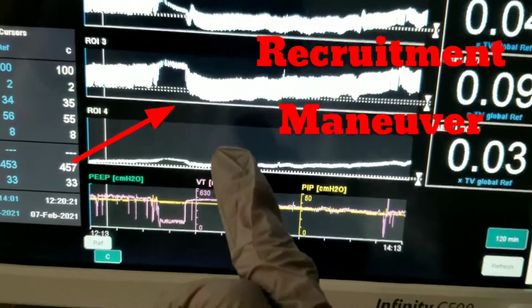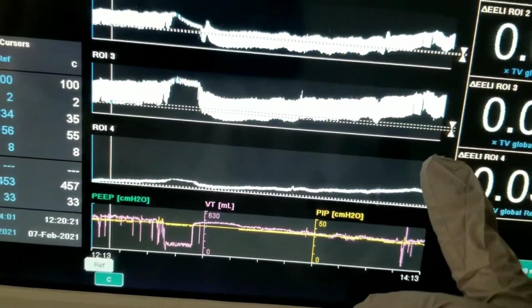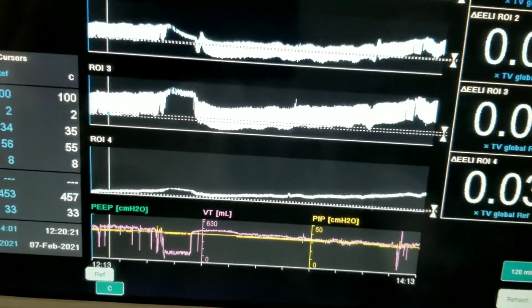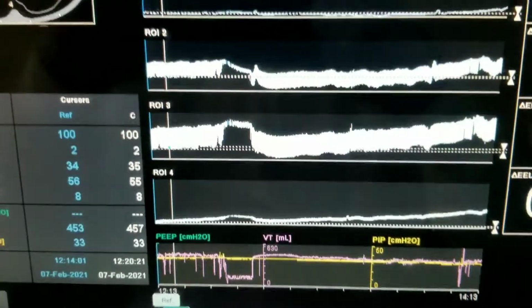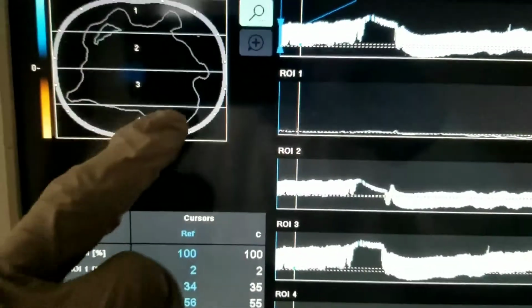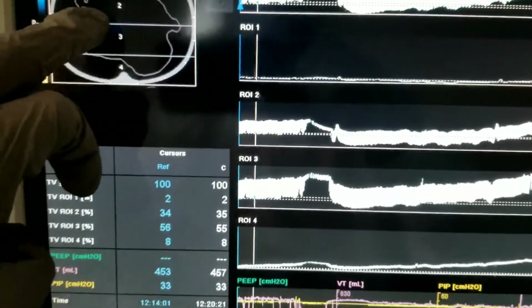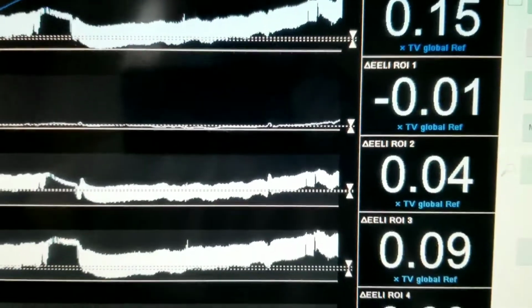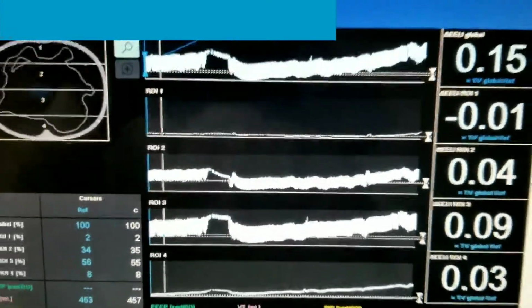So obviously we're increasing the amount of volume in the dorsal region. That's excellent, and we're doing this not by increasing the pressure, we're doing this by decreasing. Therefore, we're going to expect as we scroll some blue in this region, and eventually probably some on region 2. Sorry, it's hard to talk, film and point.